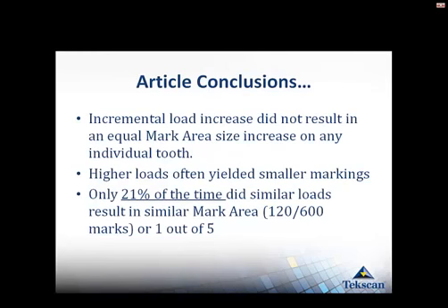Some of the conclusions from this article were that the second one here is higher loads often yielded smaller markings. And why I like that is because it's really the opposite of what has been taught traditionally. And so what we see with T-scan is that often a smaller mark is actually more forceful. It goes back to, if you think of a woman walking on a wood floor with high heels, is that going to cause more damage, the high heel, or is a men's loafer going to cause more damage on the wood floor?